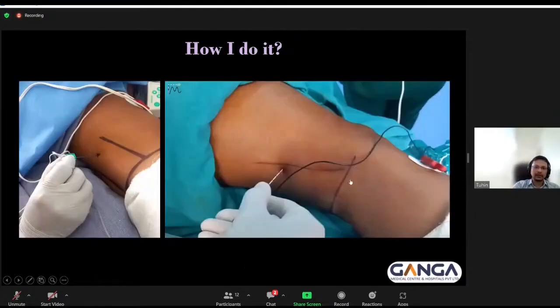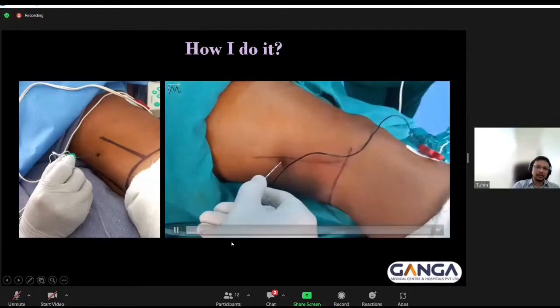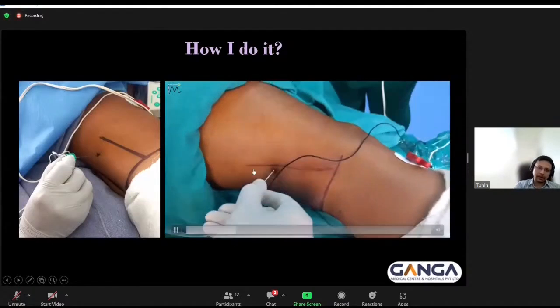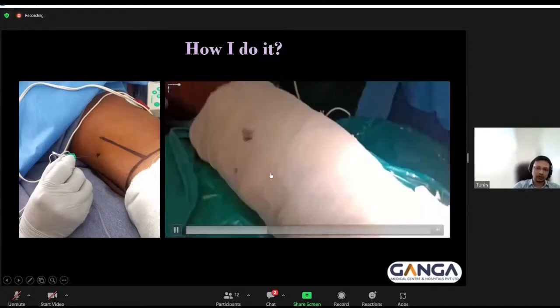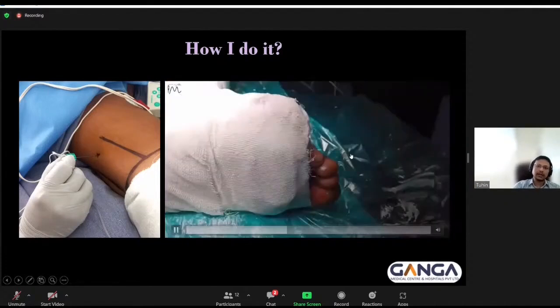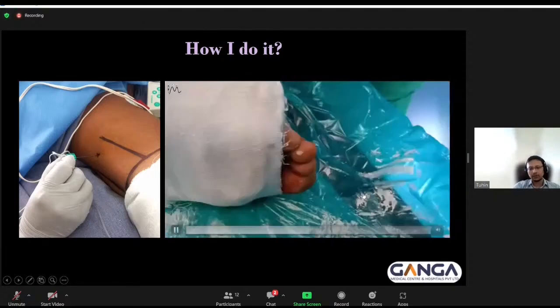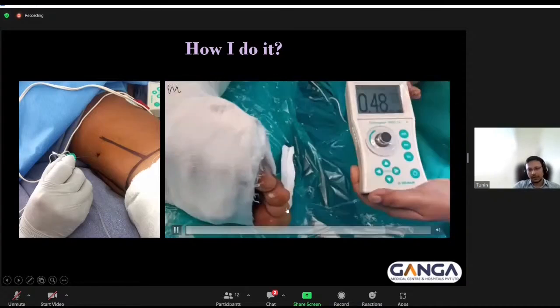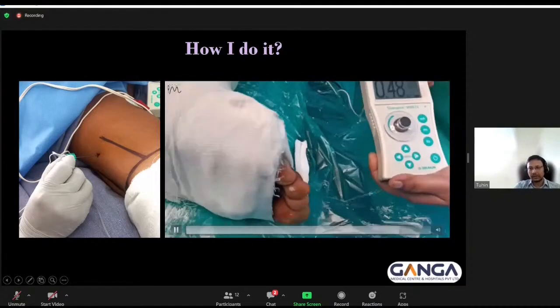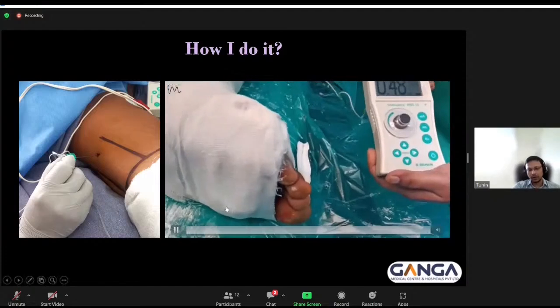So here you can see performing the popliteal sciatic nerve block, PNS guided, in lateral position. The needle entry point is close to the biceps femoris tendon. Again, here this is the distal approach. So here only the plantar flexion or the inversion are desirable. So first start with 1.5 or 1 milliamps and then gradually decrease it to 0.4, and with 1 ml of local anesthetic injection, the twitches will disappear.